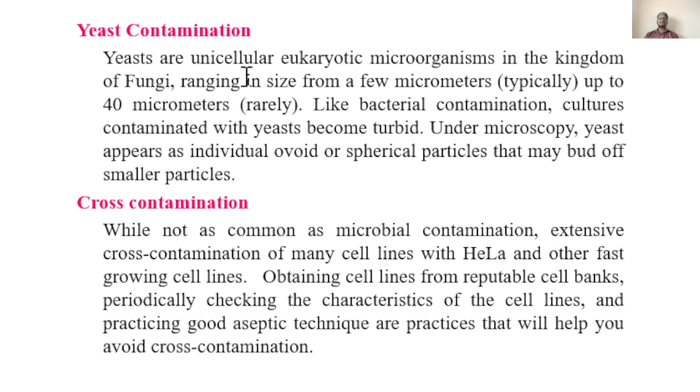Yeast contamination is another repeated contamination that people doing cell culture very often encounter. It can be identified by turbidity or a change in pH. We can easily discard the infected flask.